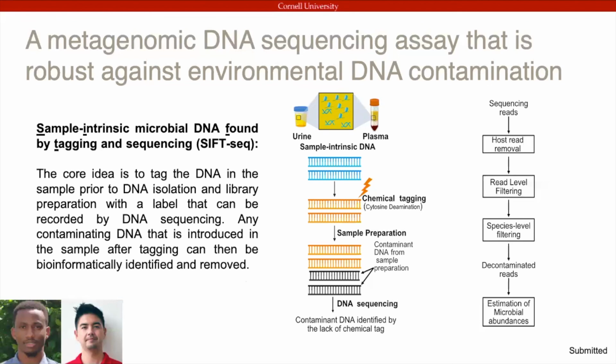Thank you. So the other question I had was on the urinary tract infection analysis that you did. Have you looked at the profiles in case of UTIs that occur independent of kidney transplant? Have you seen if the microbial profiles are any different? We have not. We have looked at individuals that had stents removed and looked at their microbial profiles before and after, and we are not seeing any difference, and we're not really detecting any significant species that stand out.